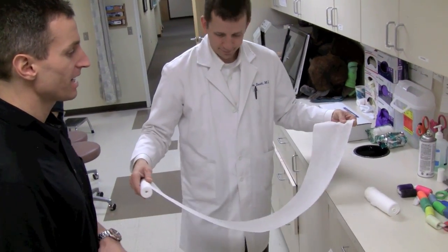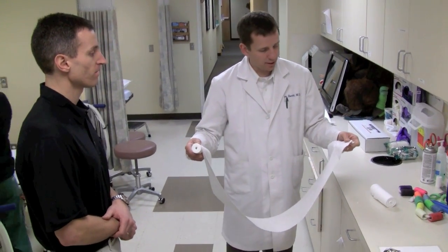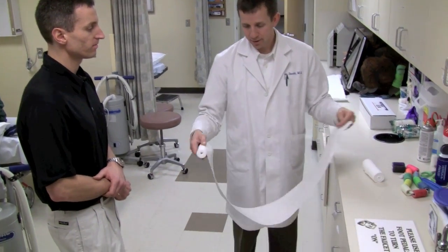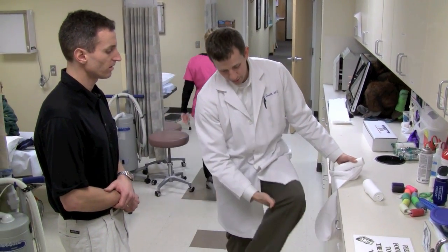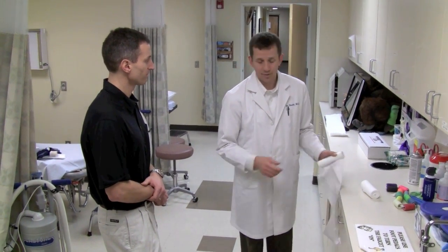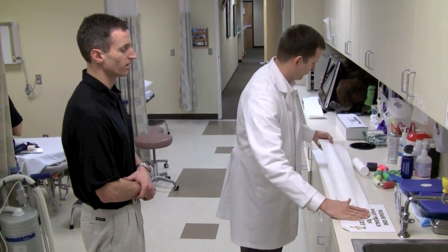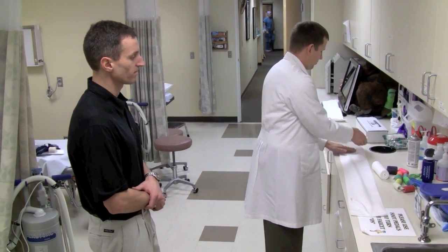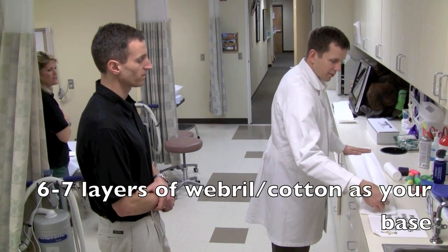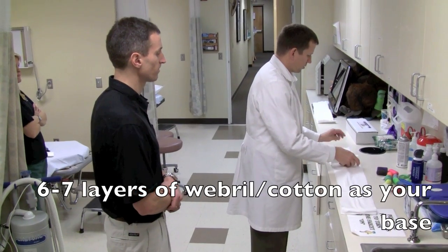We're getting our padding measured out for the posterior splint. Important things are that you want it to come out past the toes so you can fold it over, which makes it a little neater. You also want to make sure it ends below the popliteal fossa — you don't want to scratch the back of their knee. Usually this ends up being about six to seven layers thick in terms of the webril.